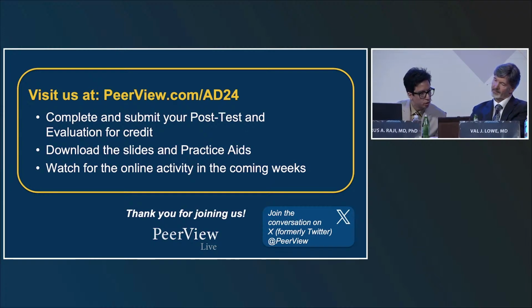I think there's another ARIA question right there. How to deal with quantitative thresholds for ARIA-H when having different MRI sequences for baseline versus follow-up, especially SWI with higher sensitivity versus T2? I think that if you have to choose between the sensitivity of SWI and T2 star, you report the SWI findings, and whatever's giving you the most information, you track that. If you're not confident you can get a good assessment, then if somebody's coming into your practice with a lower resolution T2 star scan, you should rescan them on your standard protocol. It's better to go through that step and be confident in what you're assessing than having that uncertainty, because it does have clinical implications.